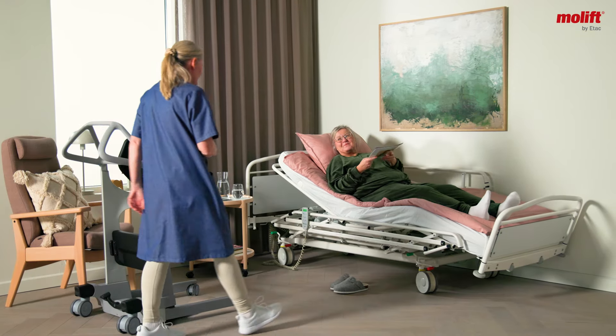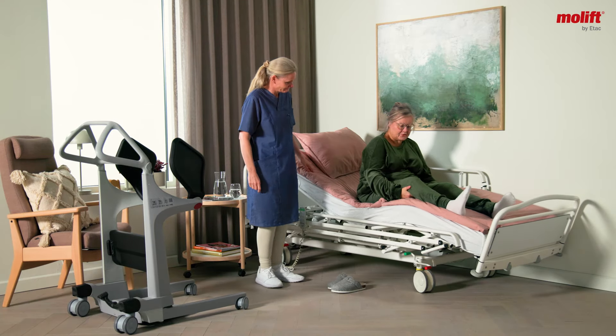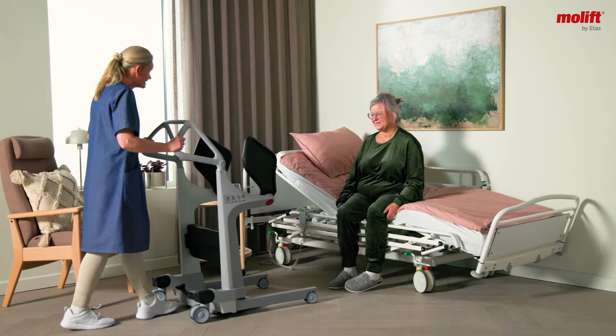In the world of healthcare, every transfer is more than just a movement. It is an essential part of rehabilitation and maintaining physical abilities. Preventing the risk of work-related injuries for caregivers is as important as the user's well-being.